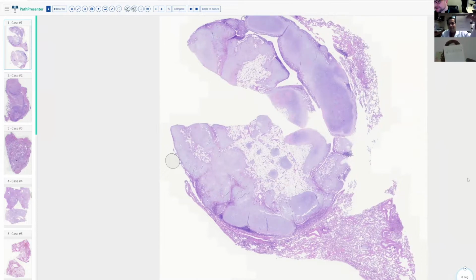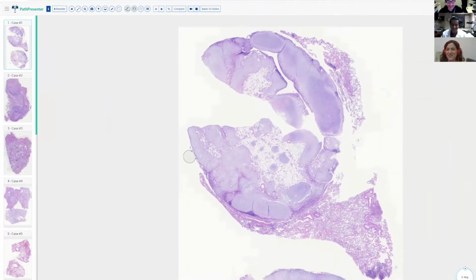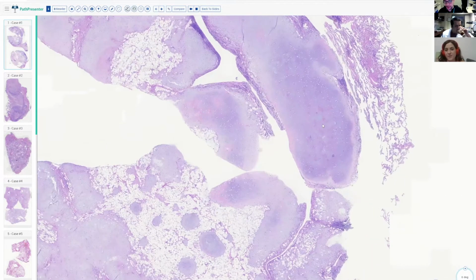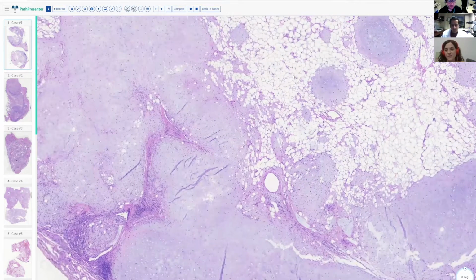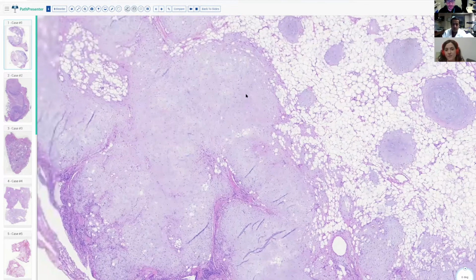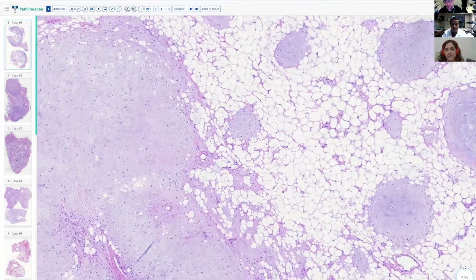So we have hamartoma and hamartoma. Perfect. Great. So yeah, that's exactly what this is. So I think this is a classic spotter that can commonly occur in practice or on exams. So we at low power have this really nicely well circumscribed lesion that's composed of a mixture of mature cartilage tissue, this other more loose chondromyxoid type of tissue here, as well as mature adipose tissue.